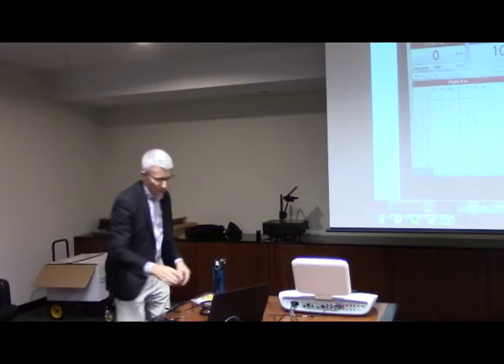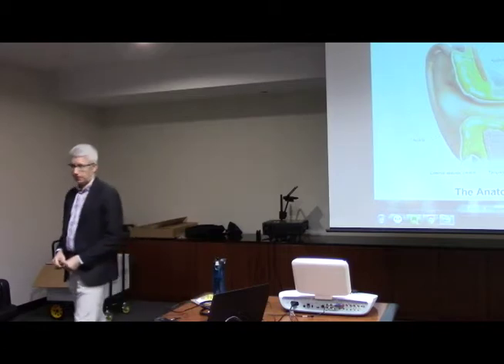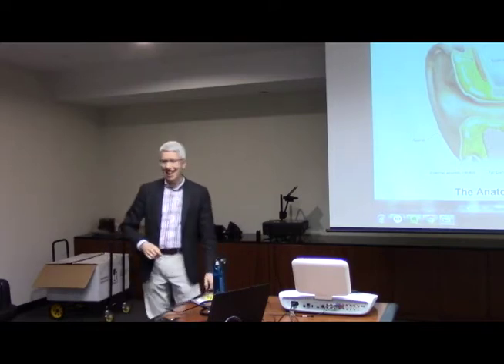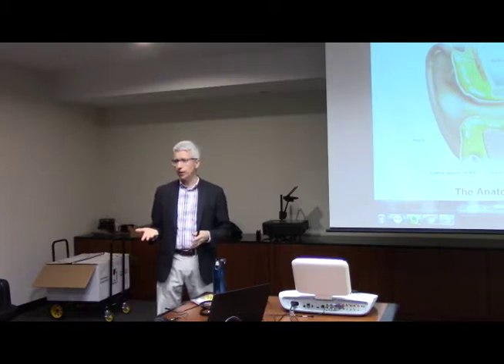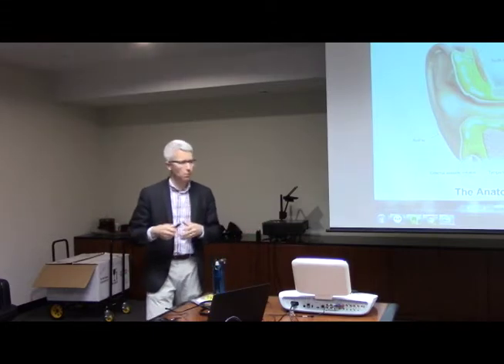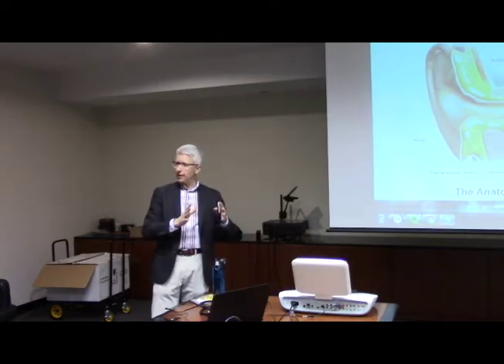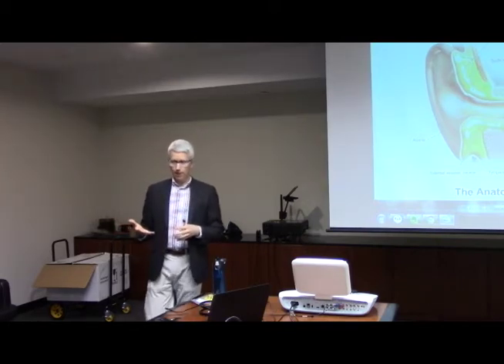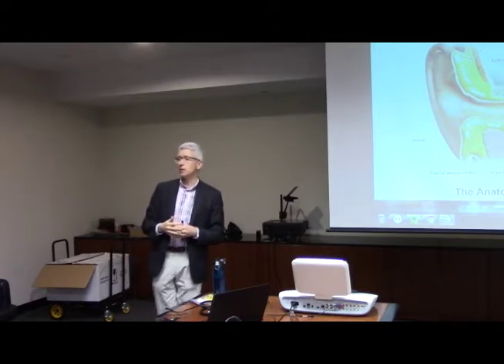Anyway, so that's right. But the audiologist is delivering this speech? There are 2 ways to do it. Stay in the picture here. Look at me. There are 2 ways to do it. The most common way is what's called monitored live voice. So I would sit there and I would be saying, say the word baseball, say the word cowboy, say the word ball, just doing all of that. Carefully monitoring how loud I'm saying it, how I'm presenting it so that it's coming out at the right level, that kind of thing. The best way to do it, and up until recently kind of a lesser convenient way to do it, is to use recorded materials.